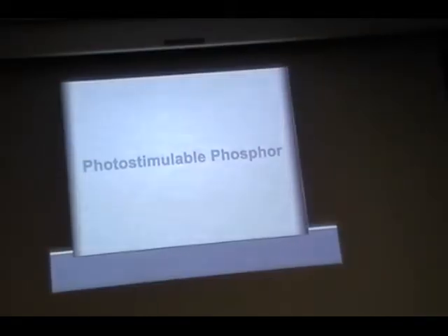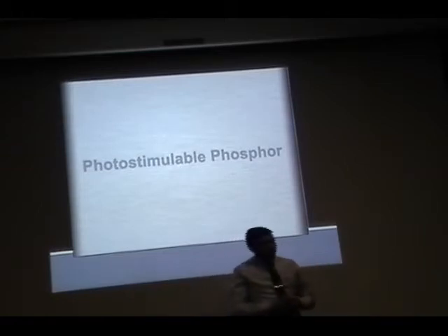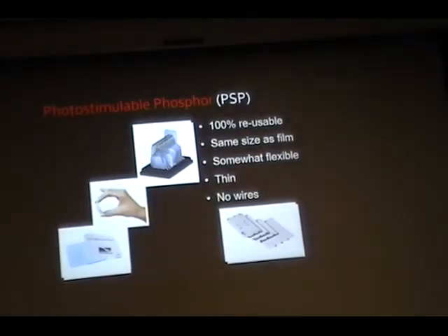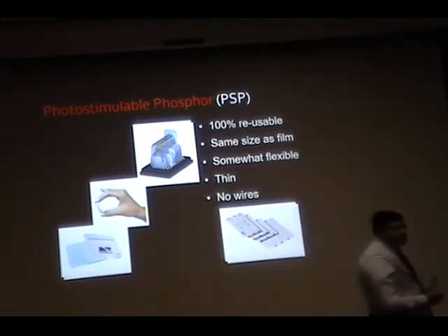And I would like to spend a little time on phosphoplates. Personally, if you ask me, I like these phosphoplates, although it takes about 3 extra minutes of processing time to pop up. The reason I like them is, one, they are 100% reusable. Same size as film, and flexibility on top of it.